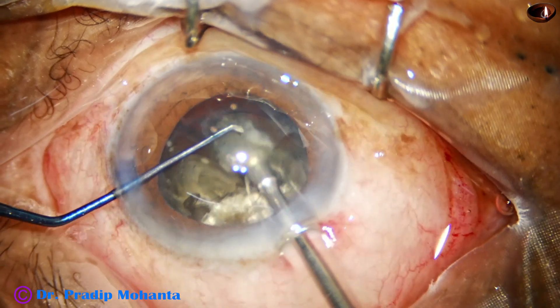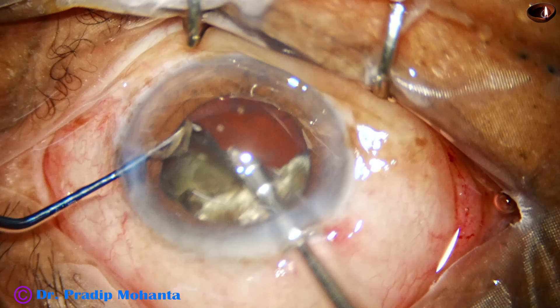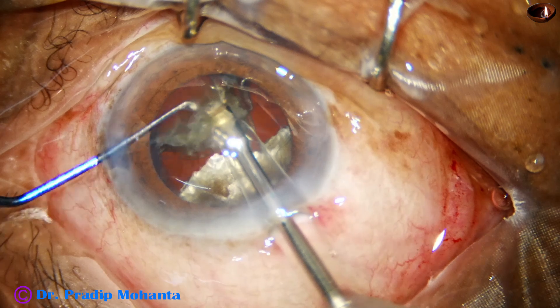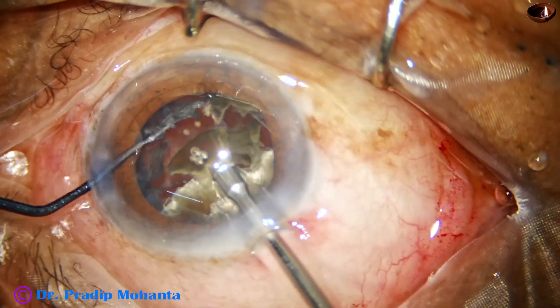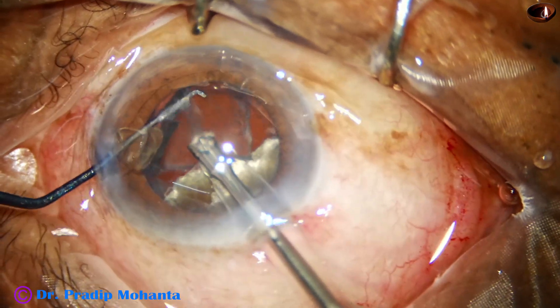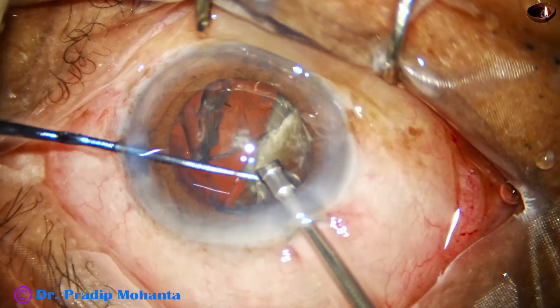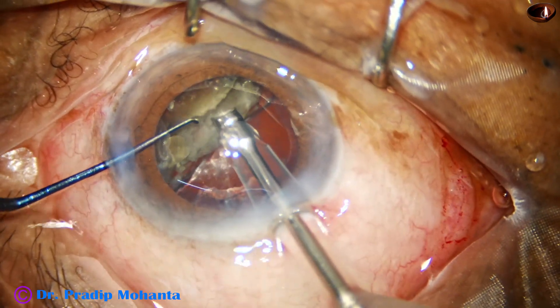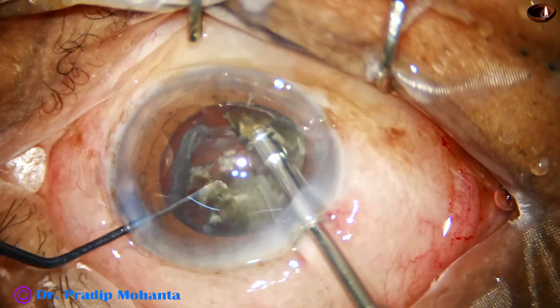The chopper is just a modified Sinskey hook — it is known as Mohanta's chopper. It's just a modified Sinskey hook, a small thing; it is just helping the phaco needle to do what it wants to do. So one hemi-nucleus has been managed. This is the epinuclear shell — let it be there and protect the posterior capsule. Now I come to the other hemi-nucleus, go through it, and divide it like this.